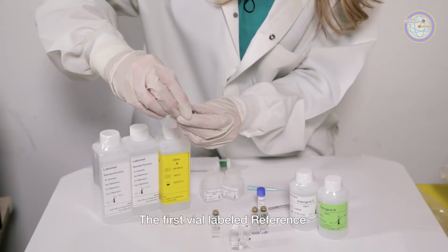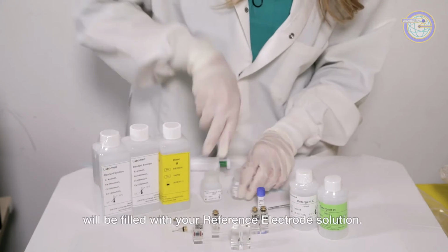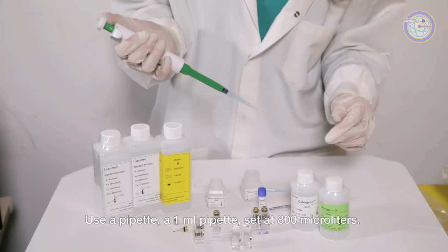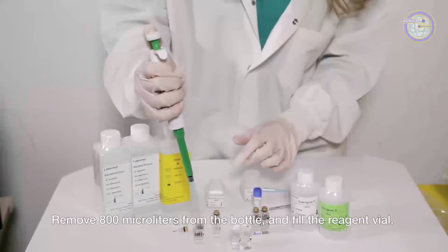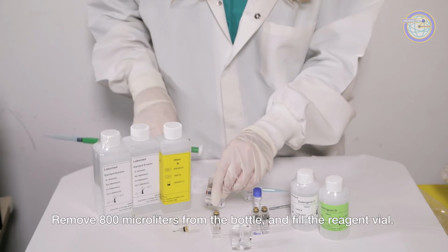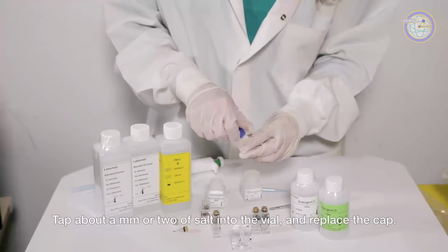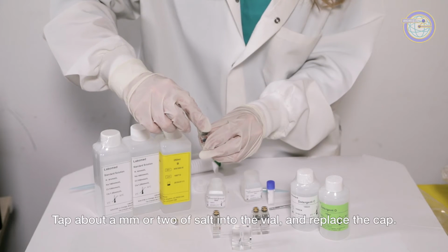The first vial, labeled reference, will be filled with your reference electrode solution. Use a pipette, a 1 mL pipette set at 800 microliters. Remove 800 microliters and fill the reagent vial. For this vial, you will want to add a little bit of salt. Tap about a millimeter or two of salt into the vial and replace cap.